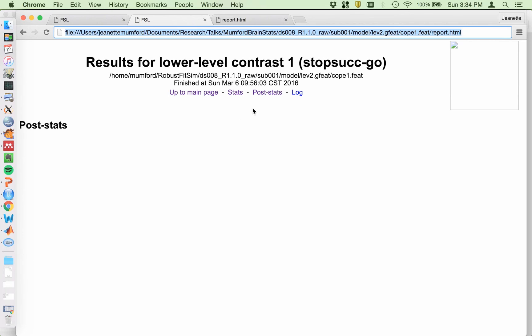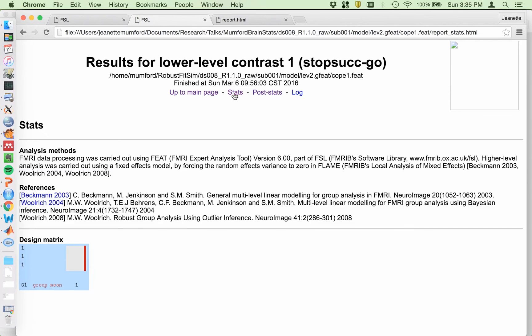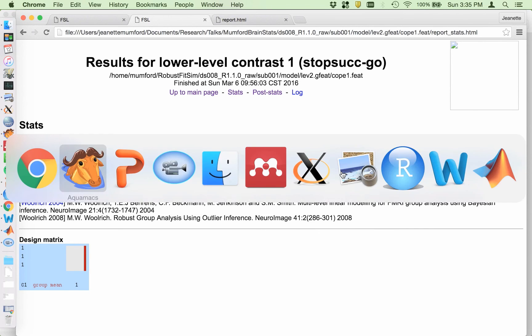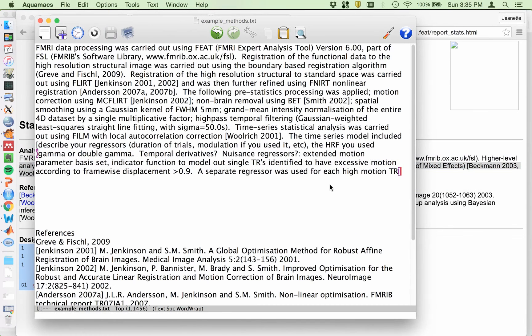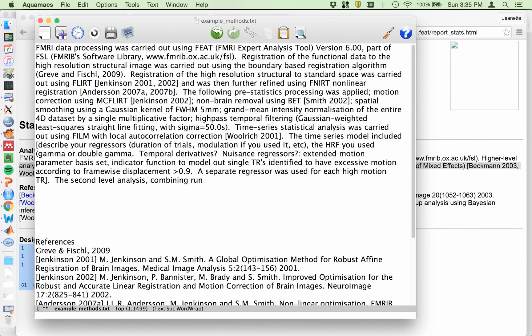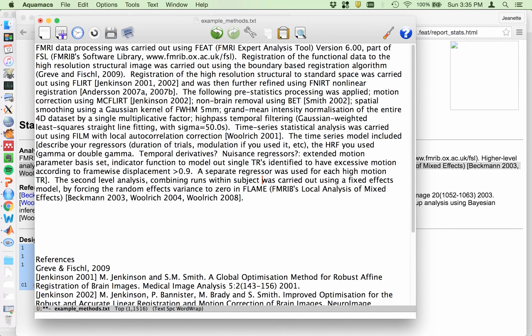So second level analysis. So I don't need to go up to the main page. Stats. So this explains the model that was used. Higher level analysis was carried out using a fixed effects level. So this just says generic higher level. I'm going to be more descriptive and say the second level analysis. So I say the second level analysis combining runs within subject was carried out using fixed effects model by forcing a random effects variance to be zero. Done. Get my references.